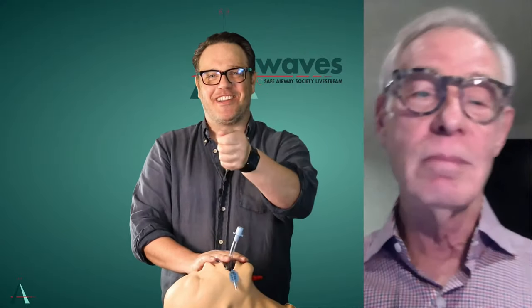Yeah, and it's funny how you get into a pattern of behaviour that certain things are allowed. The epiglottis is there in your way, and you've got a device that could lift it. So essentially, just using it like you would a straight blade to lift up the epiglottis, exactly. And that solves that problem.